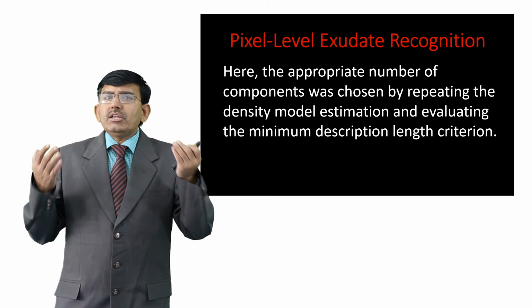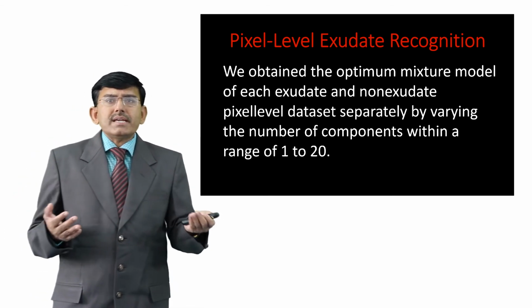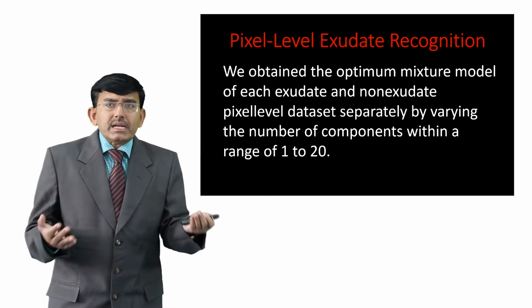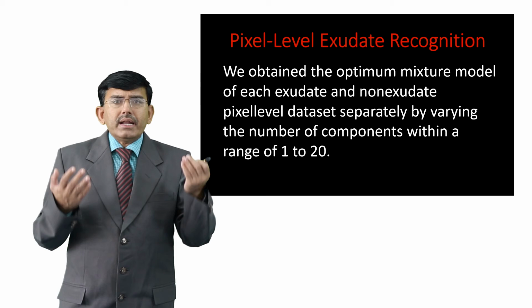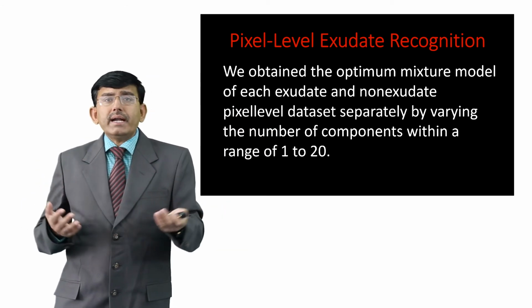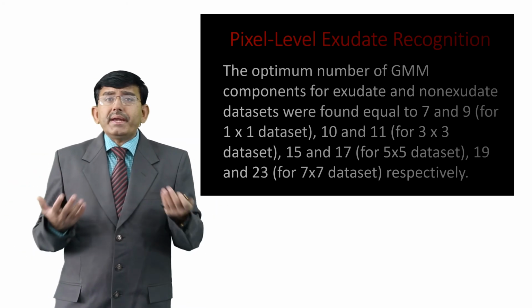We obtained the optimum mixture model of each exudate and non-exudate pixel level data set separately by varying the number of components within a range of 1 to 20, and by following that we found an appropriate result.